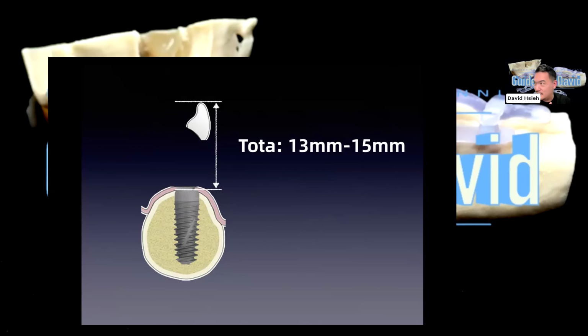It's not that hard to understand. Just like if you try to place a new refrigerator in your kitchen, right? You have to measure if your kitchen is big enough for the refrigerator. If not, get a smaller refrigerator. Then you have to make space for it before you purchase it, right? If not, it's going to be chaos. So just do your math before you put a refrigerator in your kitchen. Same thing here, exactly the same thing. So that's restoration space.